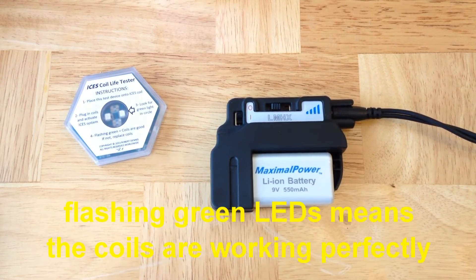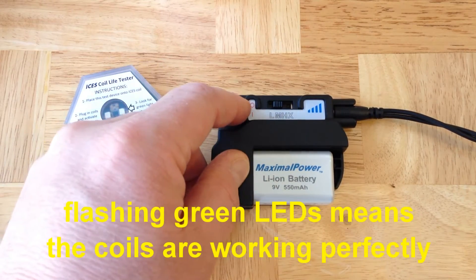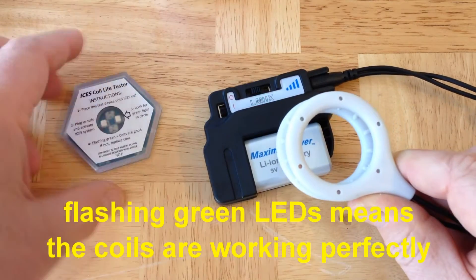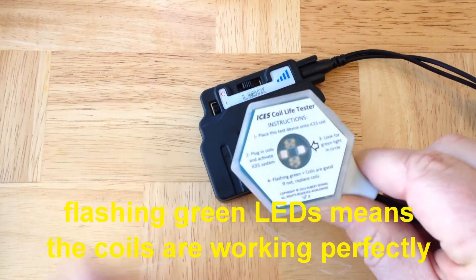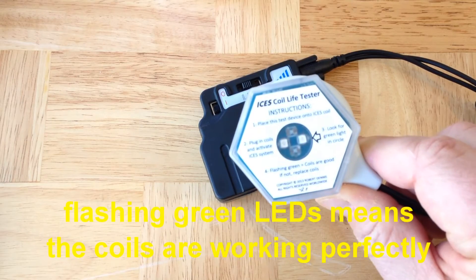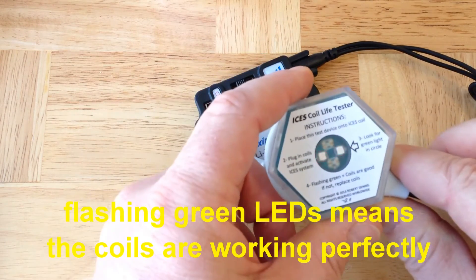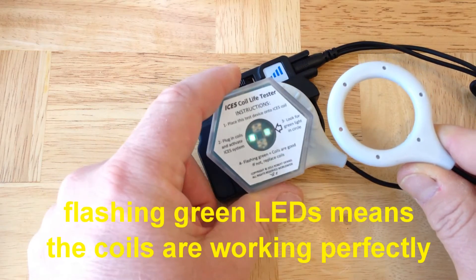Test the coils with the coil test chip — this is very easy to do. You turn the system on, hold the hexagonal coil test chip over the coils, and you'll see flashing green LED lights on the coil test chip. You can test the coils individually or test them together.